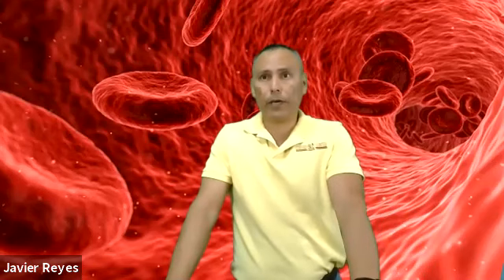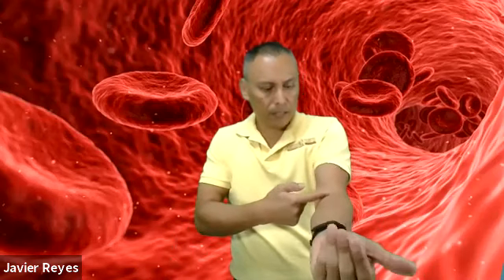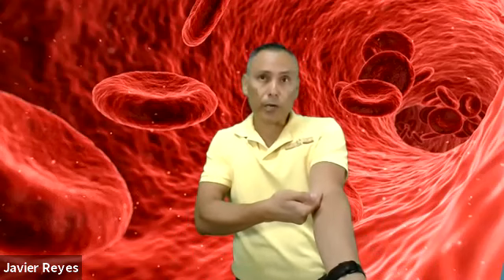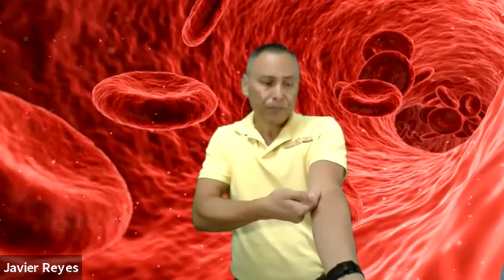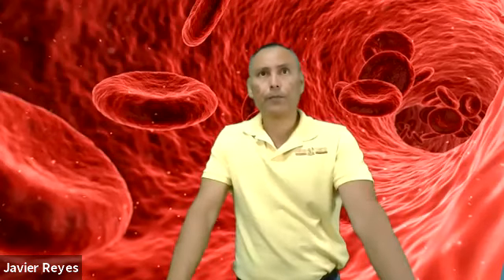That is not acceptable. The needle bevel against the upper wall of the vein prevents blood flow. When you insert into the vein, especially in the antecubital area, if the arm is bent a little bit, you might have the bevel end up hitting the top wall of the vein and getting blocked, and you might not get blood return. So try to make sure that the patient has a straight arm, and if you see blood flow, then that was the problem. If not, you might have to come back out just slightly, very slightly, without taking the needle out.